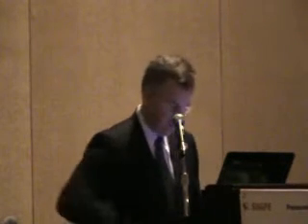So what is plaque? Well, there are two definitions. Sometimes you just see uniform thickening of the vessel, and so there's been a search to say, well, if you see a very thick wall, is that plaque? And I think the field has sort of settled down and said, well, if there's a thickness of 1.5 millimeters or greater, that should constitute plaque. That came out of the Mannheim Consensus Conference that was held some years ago that I attended. The other definition that came out of that was a focal structure that encroaches into the arterial lumen of at least 0.5 millimeters, or 50% of the surrounding IMT value. So two definitions of carotid plaque for those of you who might be interested.